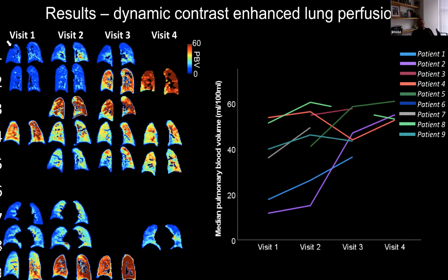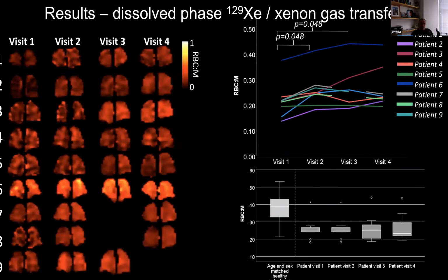The hypothesis is that the red blood cells are just not getting into the capillaries, because you don't see any focal large scale heterogeneity in the perfusion imaging. And equally, if we look back at the xenon red blood cell membrane maps, they're fairly uniform as well. So we're talking about a diffuse abnormality here, largely in these patients scanned post-COVID.